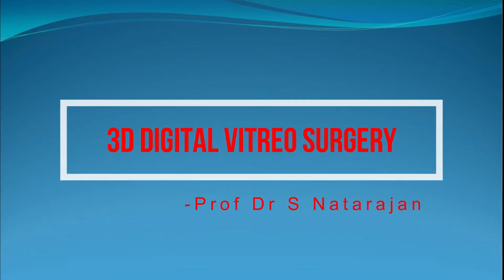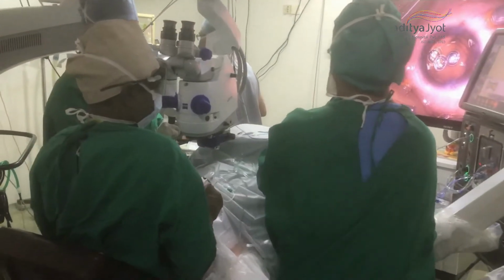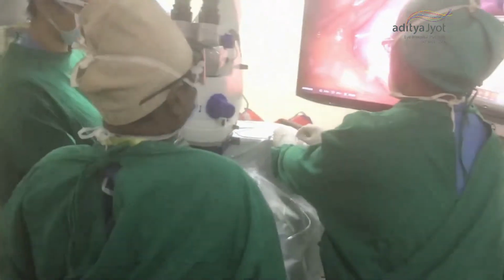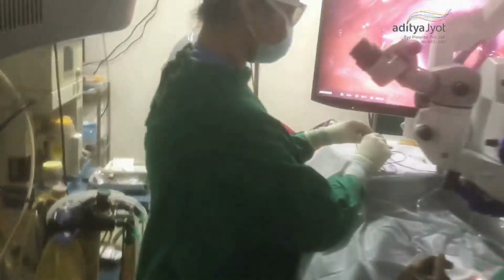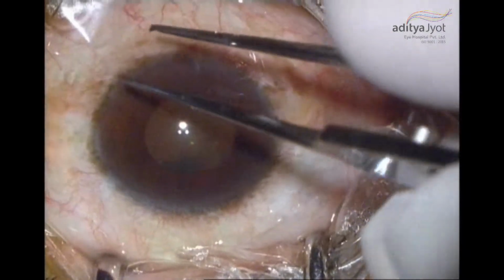This is my video on 3D digital vitreous surgery. I am Dr. Natarajan and I perform 3D vitreous surgery. I don't have any financial interest, and we are using the Zeiss ARTEVO 800, and you can see me wearing the 3D glass. My fellow is wearing 3D glass and my nurse is wearing 3D glass.